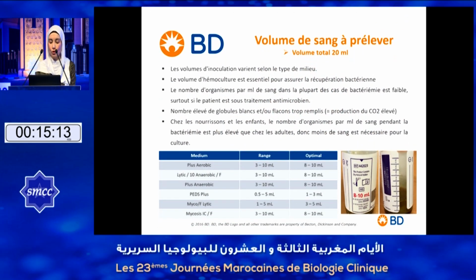Le volume de sang est très important selon le type de patient qu'on a. Chez les adultes, on a besoin d'un volume de 20 ml de sang. Donc, comme on a dit tout à l'heure, c'est dans deux flacons différents, un flacon d'hémoculture anaérobie et un flacon aérobie, donc 10 ml dans chaque flacon. Pour les flacons pédiatriques, le volume doit être diminué.